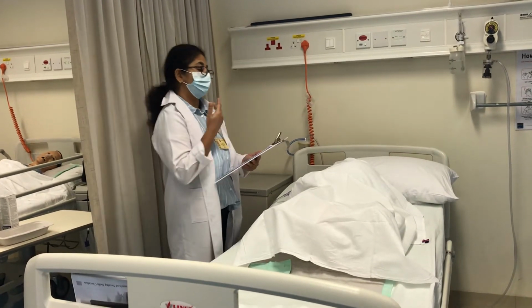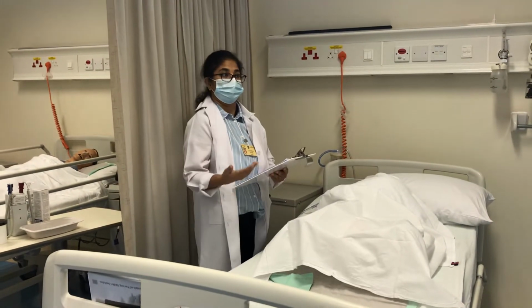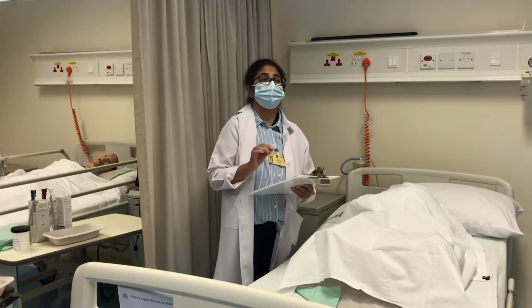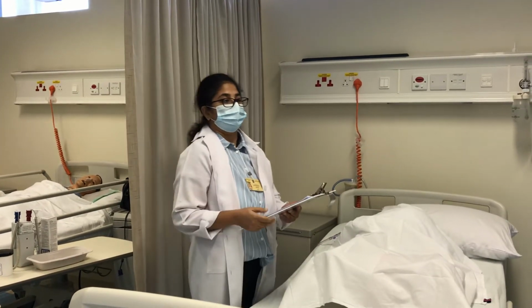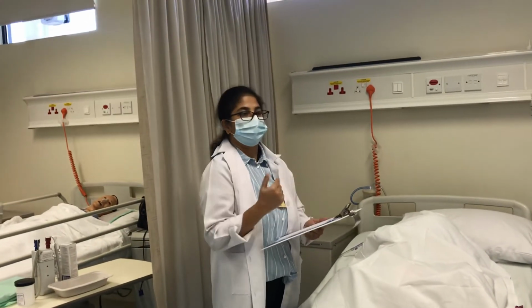And I need to introduce this particular procedure, what we are going to do about the urinary catheterization, and obtain consent from the patient if the patient is conscious and understanding. Otherwise, we need to explain the procedure to the relatives who are there.